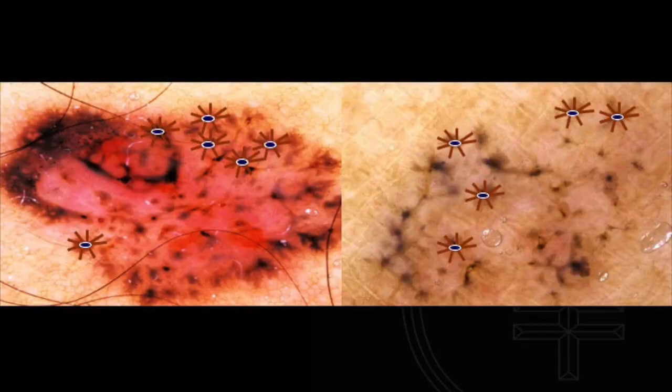So two superficial basal cell carcinomas. I will highlight the spoke wheel-like areas in these, then remove the spoke wheels. And so that's sort of been the classic spoke wheels. But let's look a little bit closer at this basal cell. And notice, well, is that really a spoke wheel, or is that kind of more leaf-like? That for sure is leaf-like. Maybe that's more spoke wheel. How about this, right? That. So you can start to appreciate that there's a little bit of play, all right?